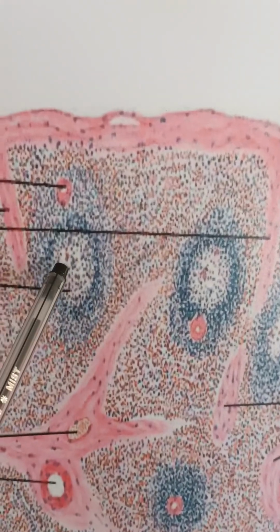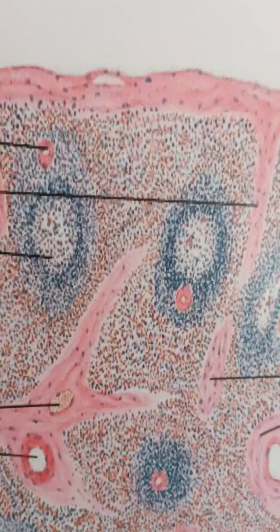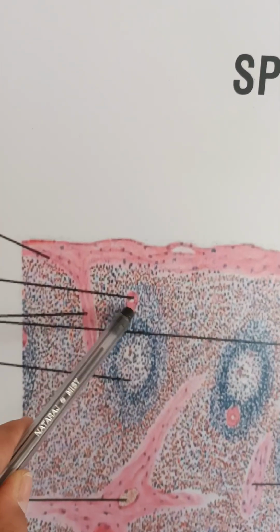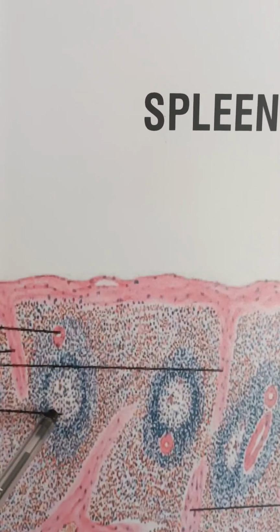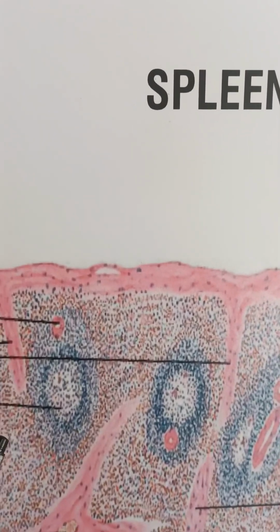All these are the rest of the space, and that is again white pulp, and it has got a germinal center here. At some places these B cells proliferate on exposure to antigen, and they develop these germinal centers. When they are developed, they push this central arteriole to the corner, and that's why we call this eccentric arteriole. They are no more central, but are pushed to the corner. So again, this is only because of the proliferation. You remember PALS, T.